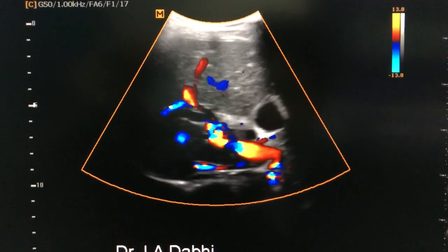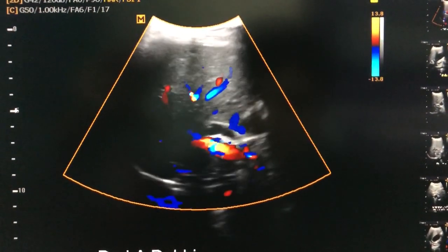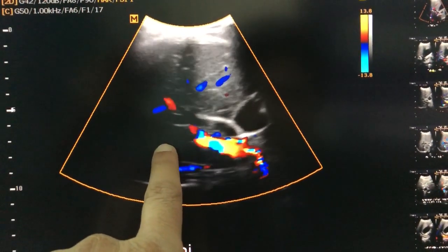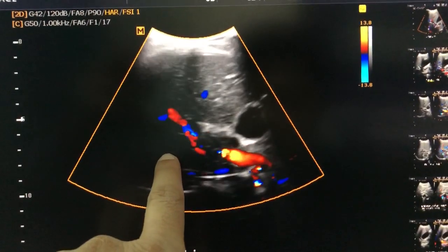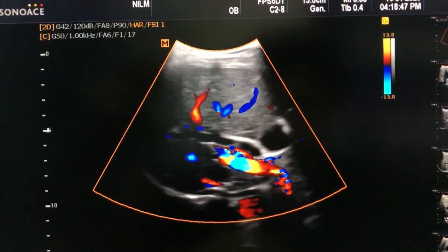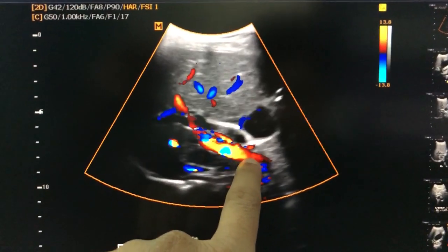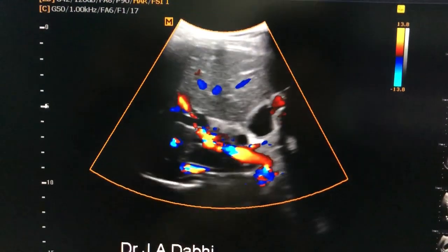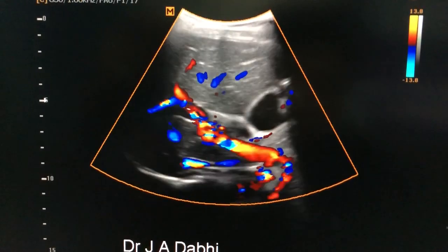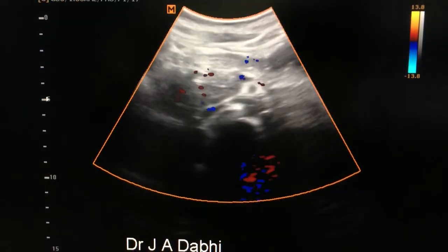More commonly, I think it is the hepatic duct, inside the liver. This is the intra-hepatic biliary dilatation, measuring around 5–6 mm. I had not visualized any calculus still.